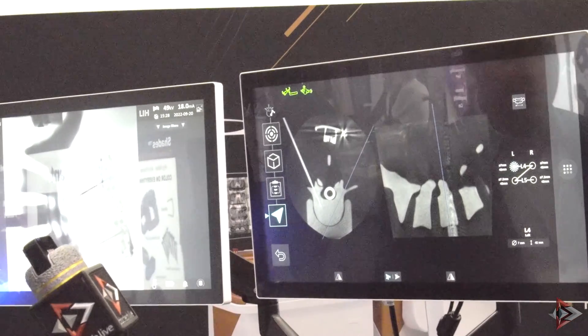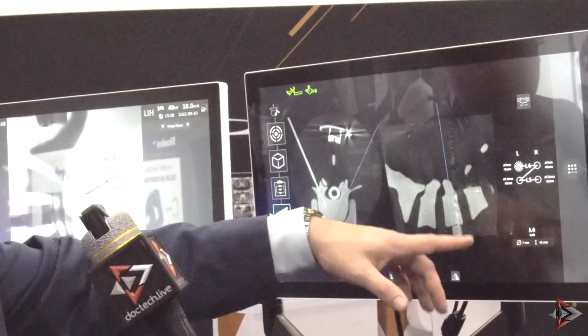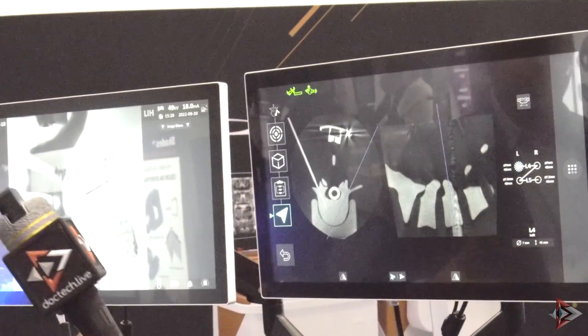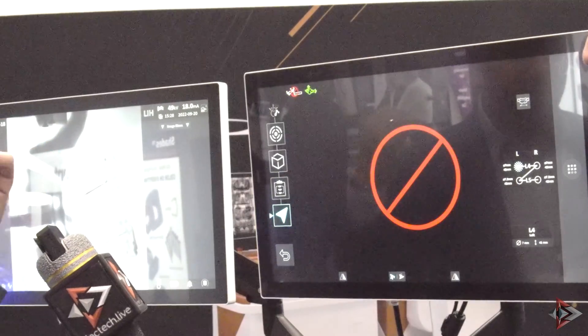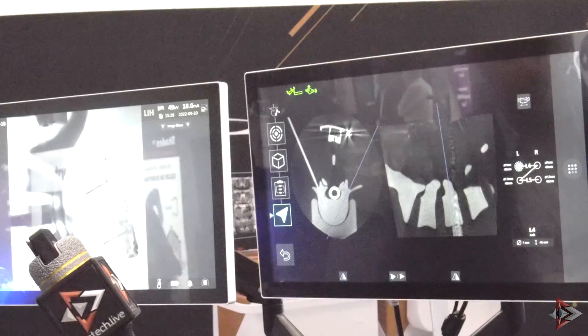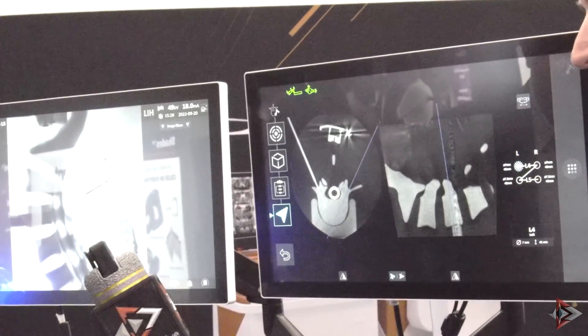It seems simple, but that's because it is. You don't need somebody over here pressing the buttons or telling them where to go — you can control that from this side with those two buttons on the robot.